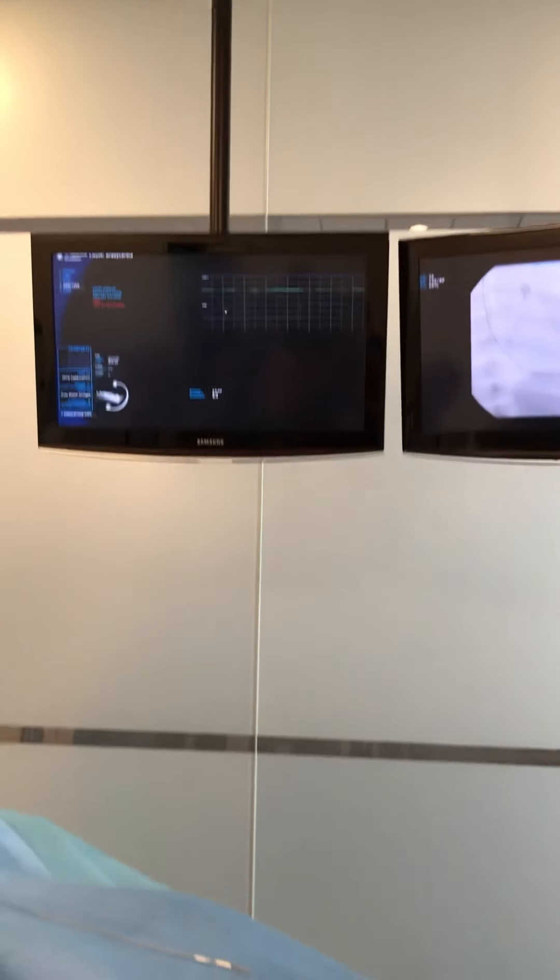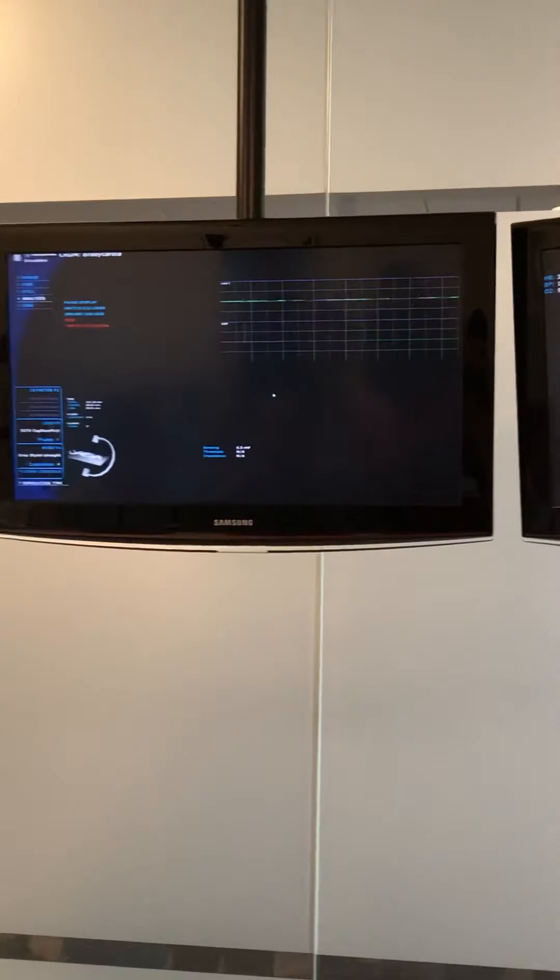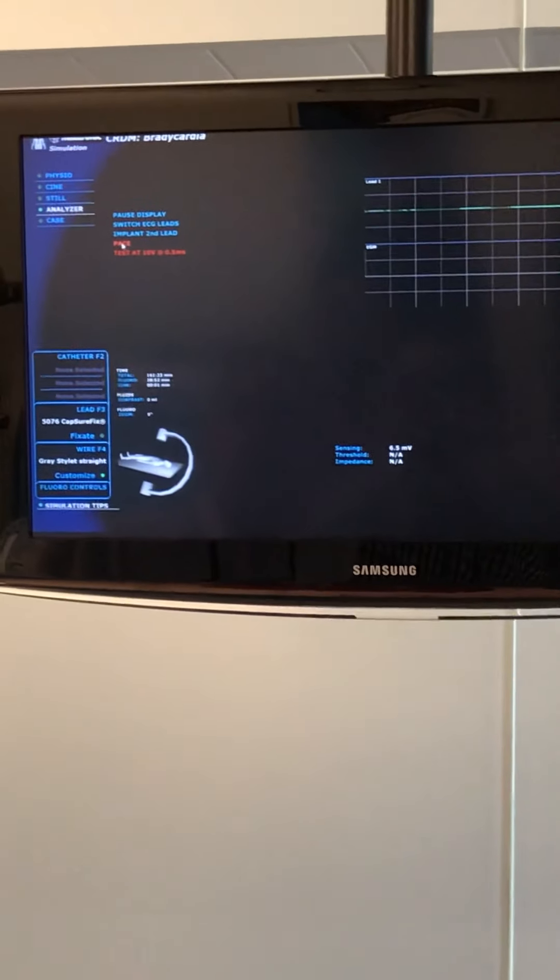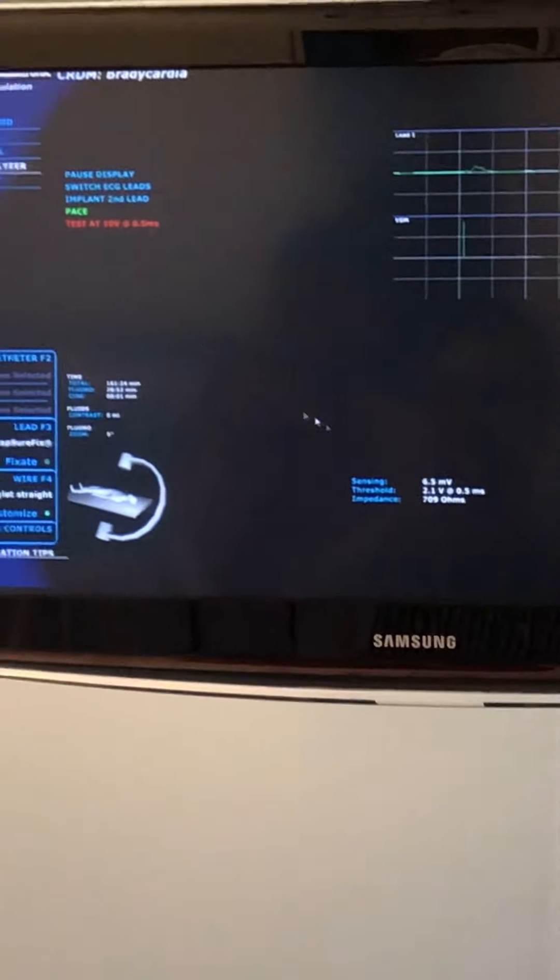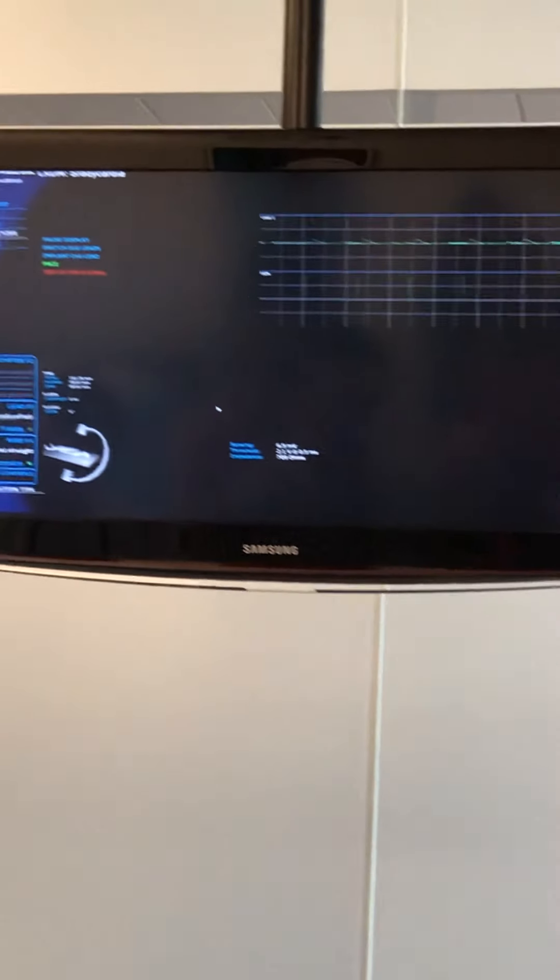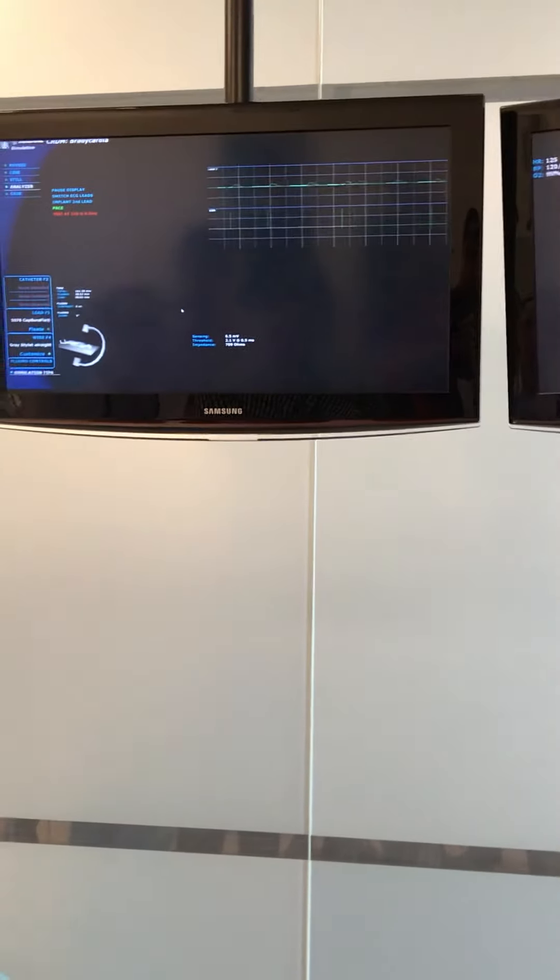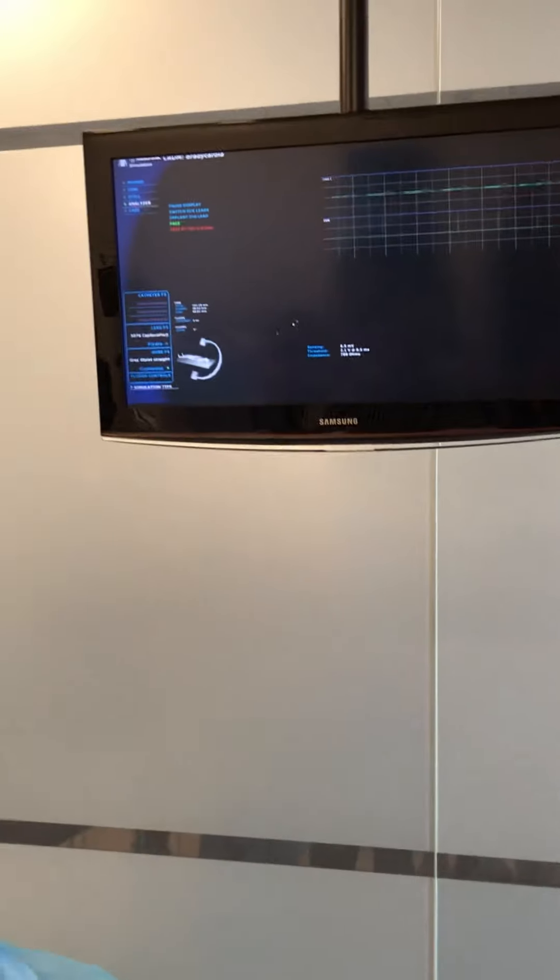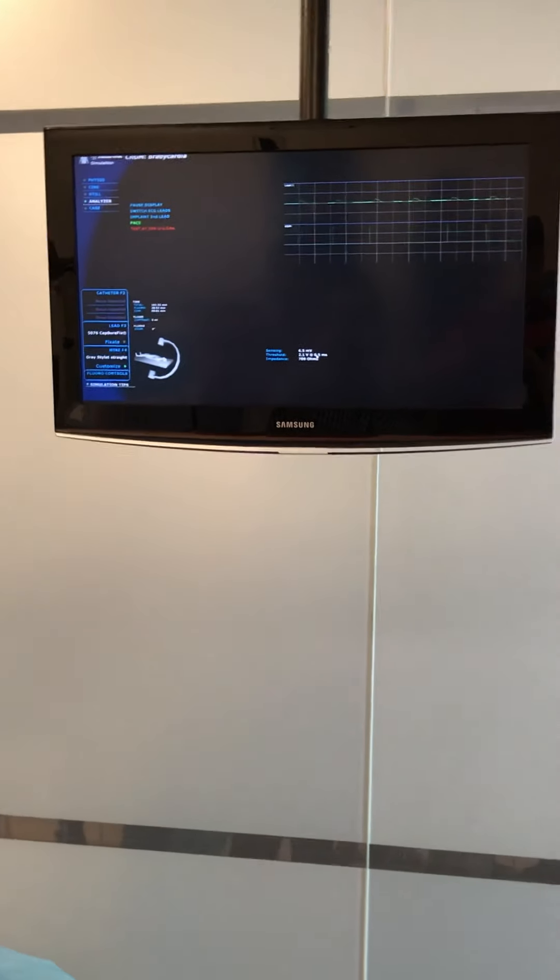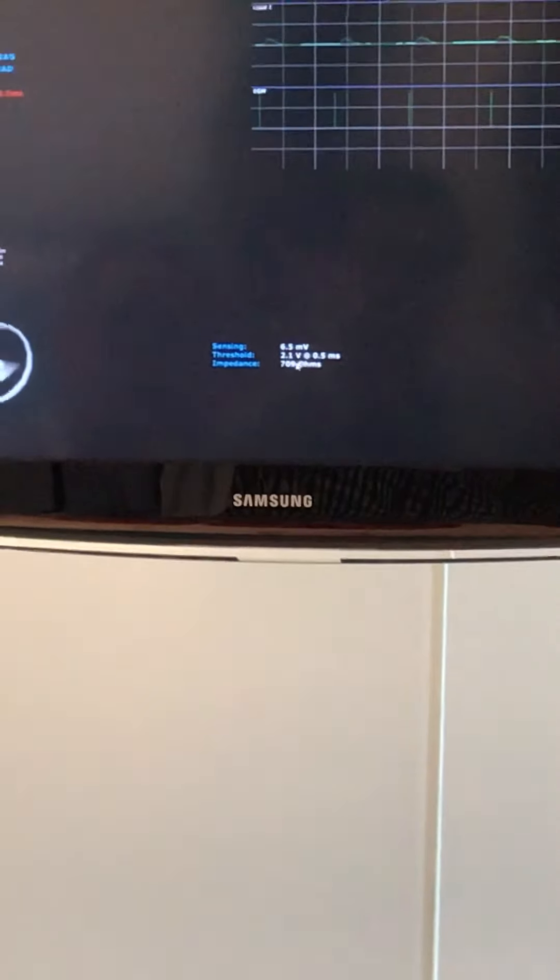Our R wave is six and a half. Let's go, Elliot. And we want to be above five or above. Bigger the better. Now check pacing thresholds. We're connected through the analyzer, which would really be over here. We figure out our threshold is 2.1 at 0.5 with an impedance of 709 ohms.